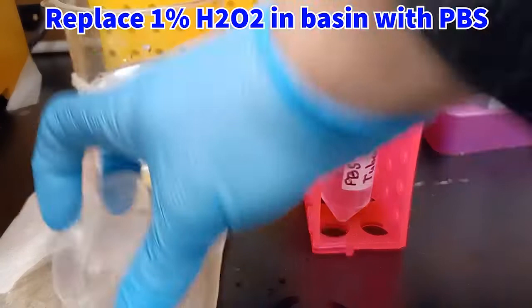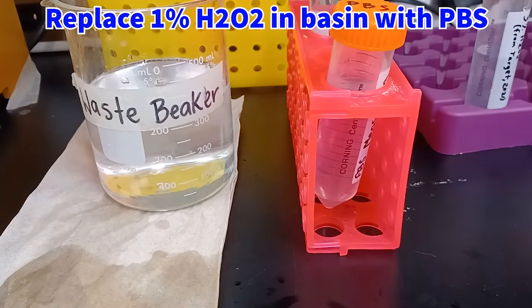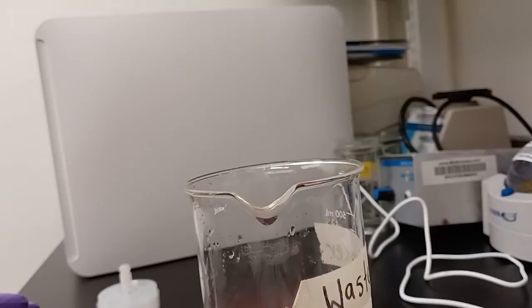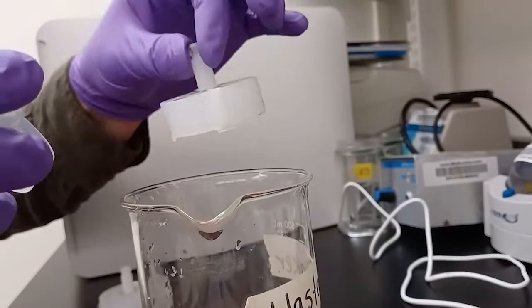Retrieve your netwell, remove the netted insert, discard the solution in the basin, and then replace it with regular 1x PBS. Reinsert the netted insert and place the netwell back on the shaker. After 5 minutes of shaking, remove the netwells, remove the netted insert from the basin, discard the solution in the basin as waste, set the netted insert on the counter — not a paper towel — and then pour new PBS solution into the basin.